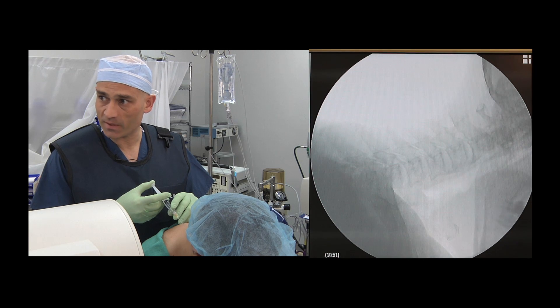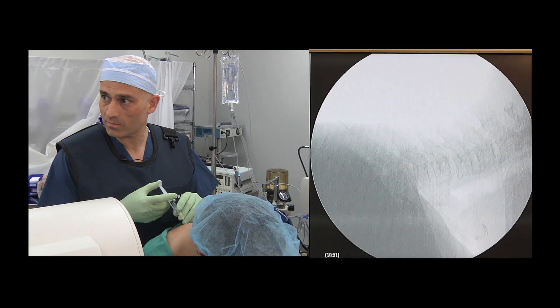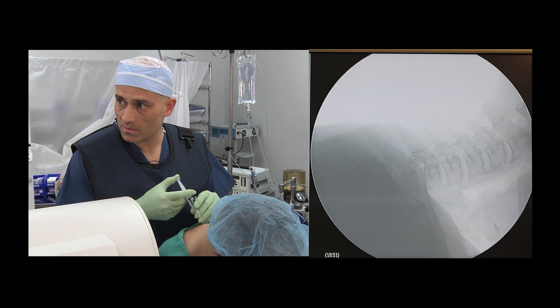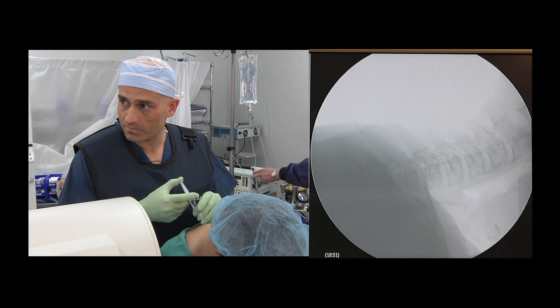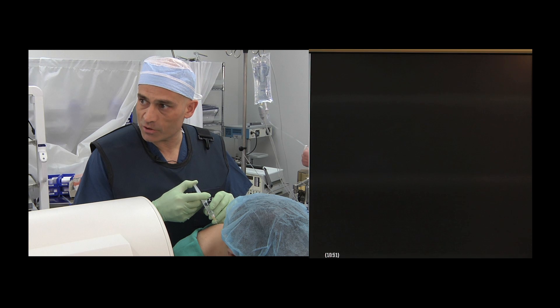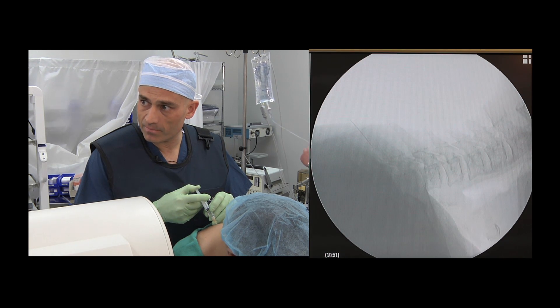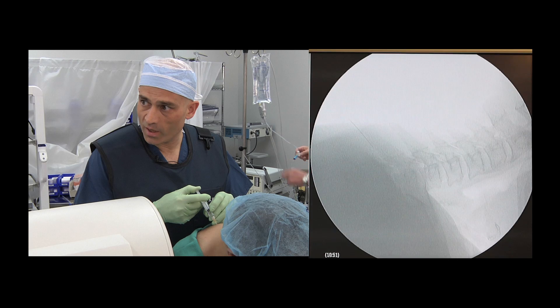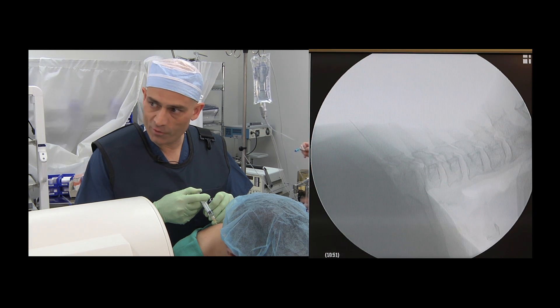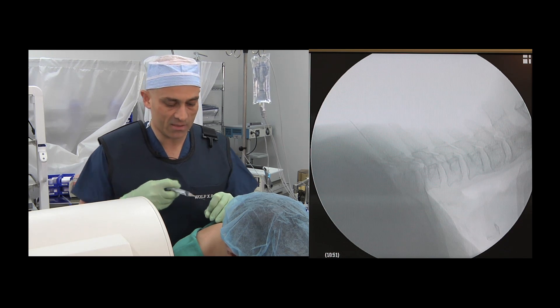Under fluoroscopic guidance, the needle is advanced into the space between the spinous processes. The local anaesthetic solution is injected to anaesthetise the area. We are at the C7-T1 level, and approximately 3 to 4 cc's of 1% lidocaine is injected.